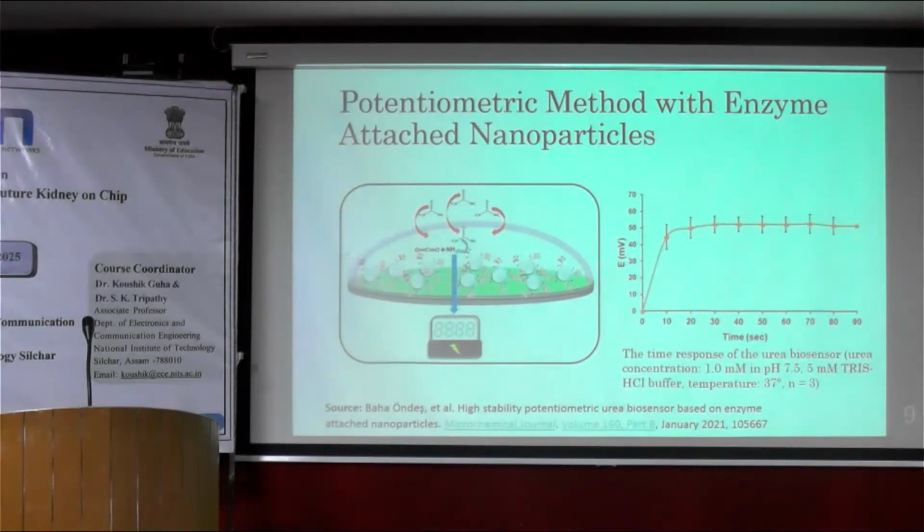That means that the enzymatic method, despite being a promising method for that, and despite the fact that we can acquire a very stable electrode, we still have to be sure that this particular sensor will operate for at least 1 year, or it would be even better if it will operate even within 5 years.